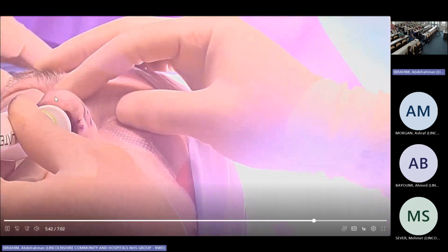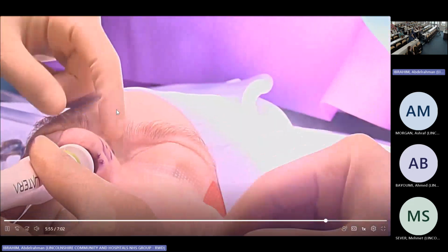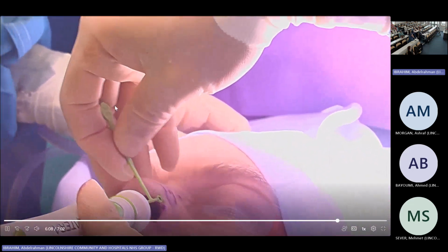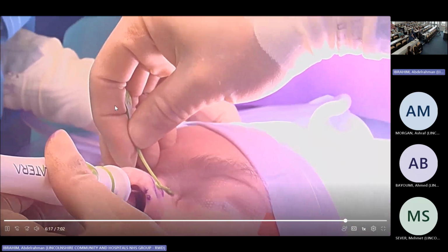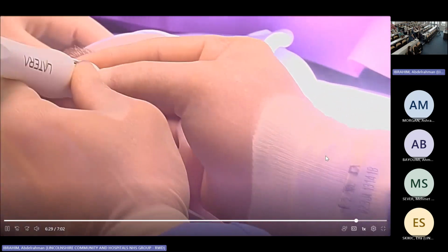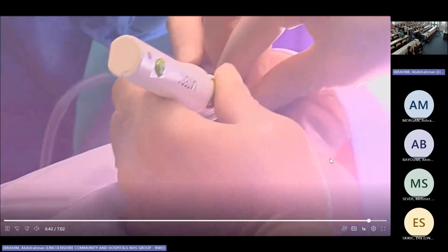Now, once I'm happy that we are in, and my direction is correct, I'm going to push the button in. And if I'm in a bit of doubt of the direction, I have this kind of lead to tell me where I am and what is the right direction. Okay. And now fix, release. Once it's in, make sure that you are supporting the upper bit of it, and then you can take the introducer outside.